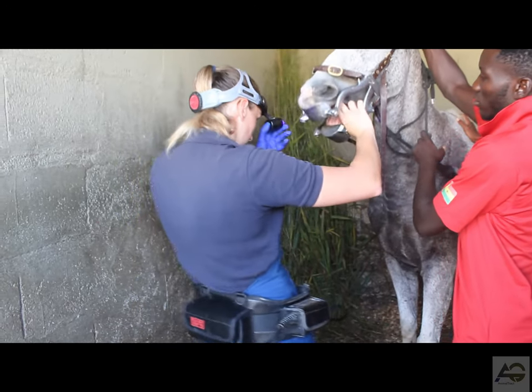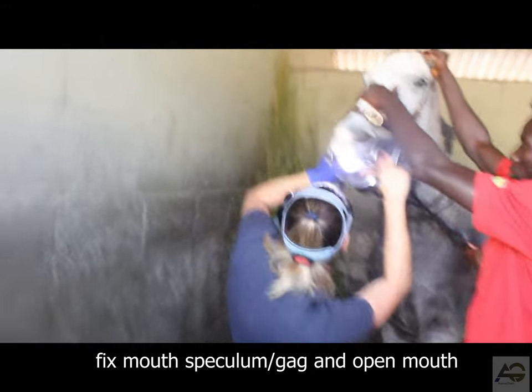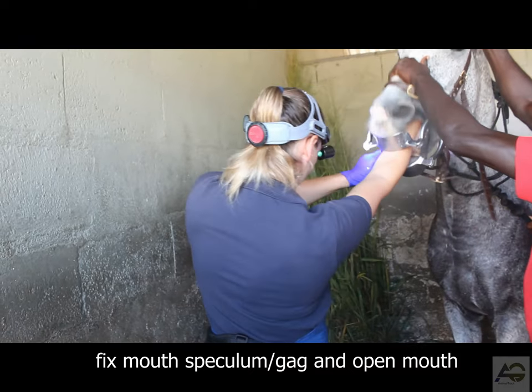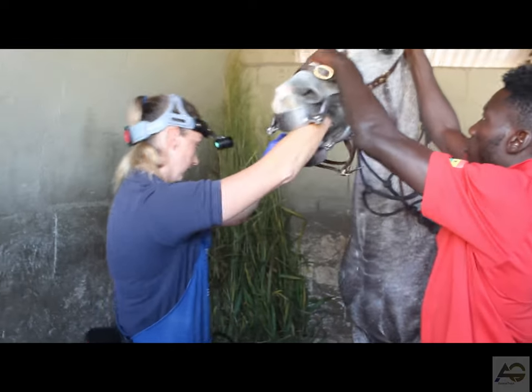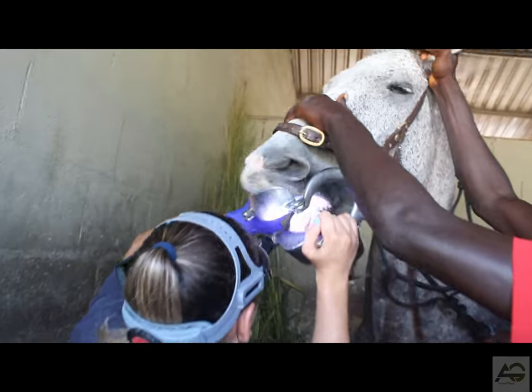Step 2: Opening the mouth. Start by using the halter and lead rope to control the horse's head. Use your hand to gently stroke the horse's neck and fix the mouth speculum, then gently open their mouth by adjusting it. Your veterinarian may need to sedate your horse to keep them calm during the procedure.